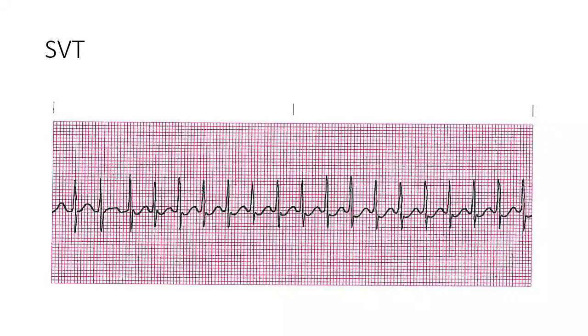So how slow did it slow down when he gave the adenosine? It dropped to about 50. Okay. It dropped majorly and then it just shot right back. So one of the things that you can do, and many times, ladies and gentlemen, you're going to be in that same situation. You're going to look at it and you're going to go, looks like this.